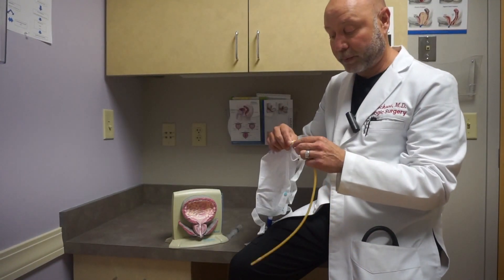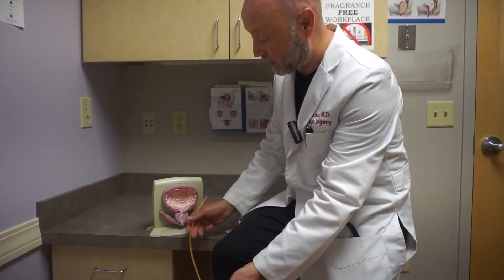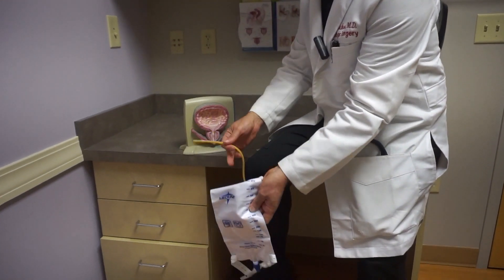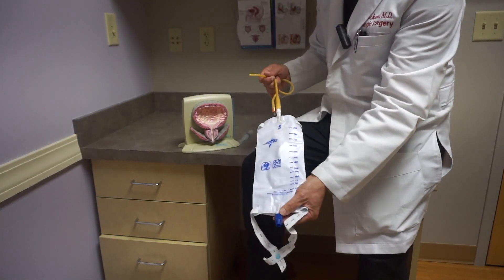Oftentimes we will have it connected to some sort of an apparatus. Commonly we use a bag, so that the tip is in the bladder, the urine goes through there, comes through here and empties into the bag — which you would then, when it fills up, empty yourself into a toilet.